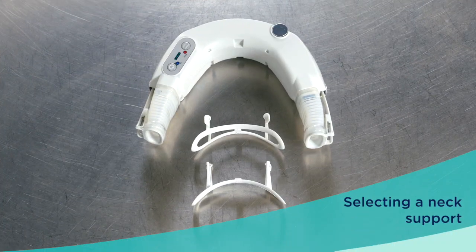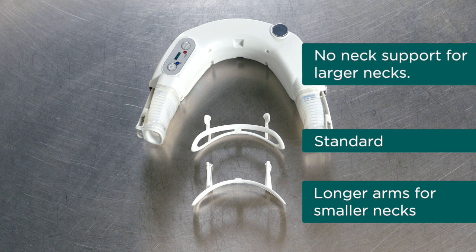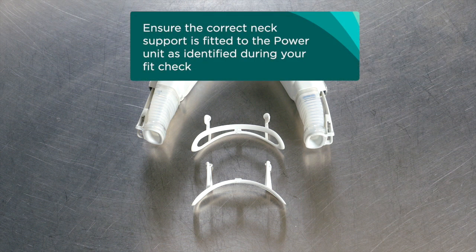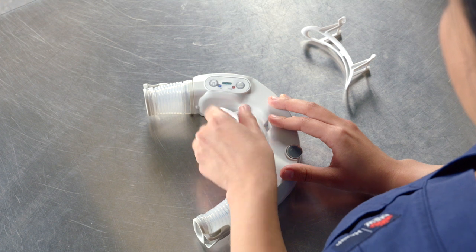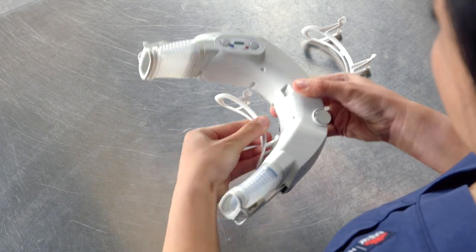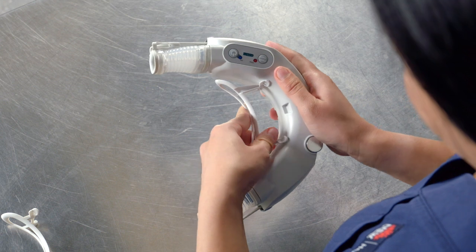There are a number of neck support options: standard, a support with longer arms for smaller necks, and no neck support for larger necks. Ensure the correct neck support is fitted to the power unit as identified during your fit check. If you need to change the neck support, unclip the two round feet at the top of the neck support and slide it off downwards. Then slide the appropriate neck brace onto the power unit and clip into the holes.